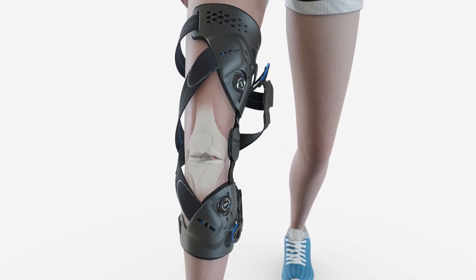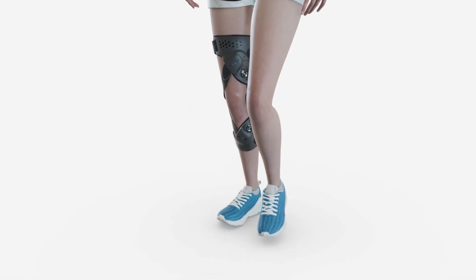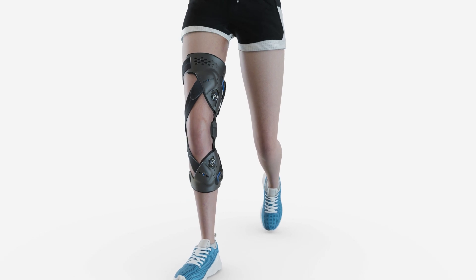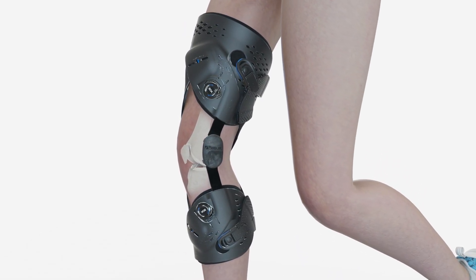Unloader 1X is clinically proven to provide pain relief and functional improvements for people suffering from unicompartmental OA of the knee and degenerative meniscal tears. Contact your local area manager to learn more about the Unloader 1X.